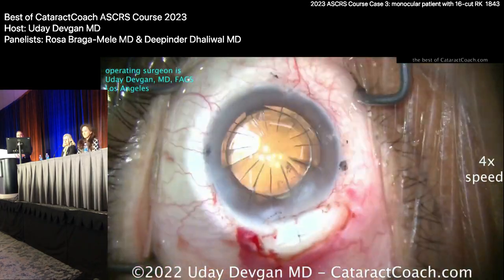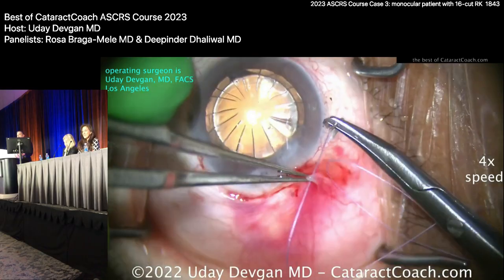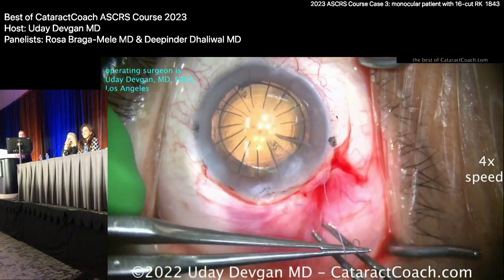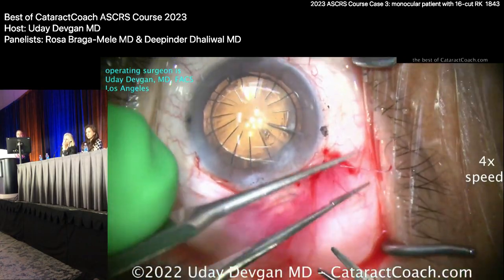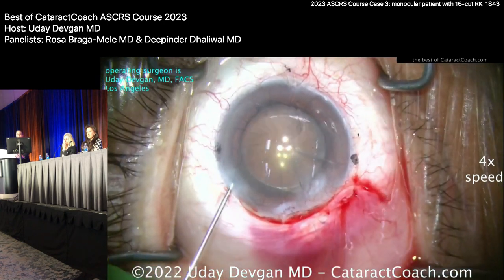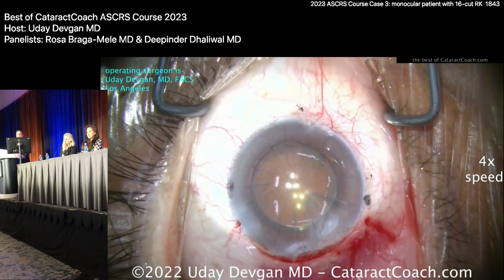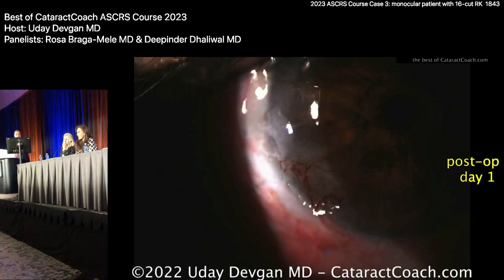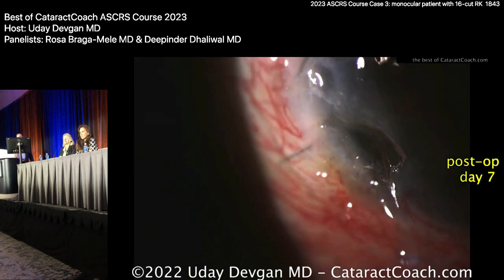You don't want me to show you all routine cases where I cherry-pick them to look like a rock star — you want to see the reality. Everything looks good, I'm pretty happy. Here's post-op: triamcinolone, antibiotic, some ocular agents just to bring the pupil down. Looks great. Here's post-op day one. Keep looking — you're going to hate me. I told the guy, don't leave home yet, don't leave L.A. He flew in to see me. Here's day seven. What do I do now?